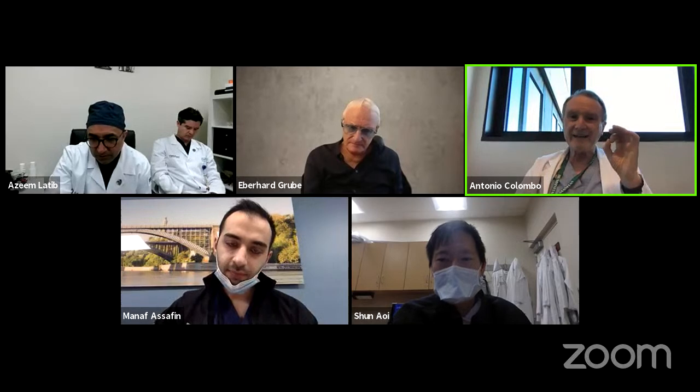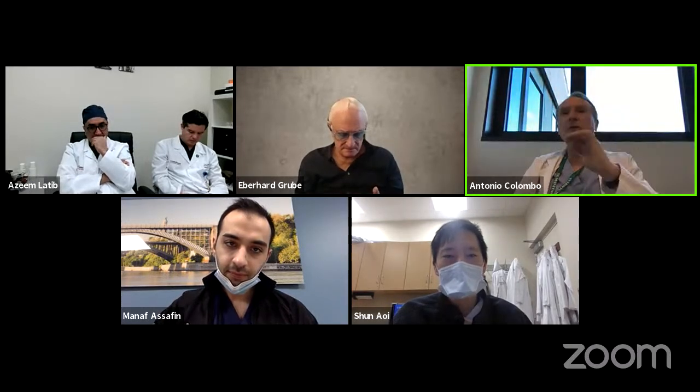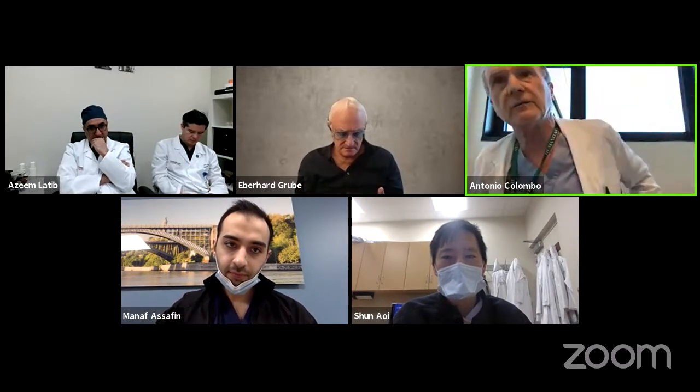Sometimes you have tiny dissections that you can leave alone, especially if you see that the residual lumen is large. How can you make this decision? First of all, should you make this decision, or should you just implant a stent and close? I tell you, I do not have the answer to this question.